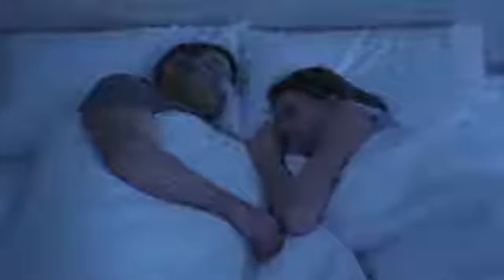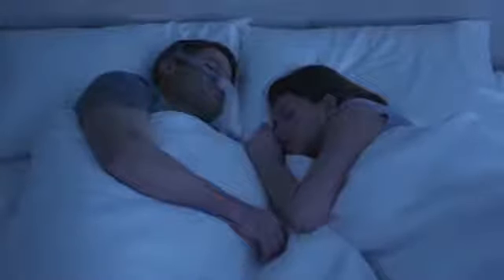ResMed's AirFit P10 Nasal Pillows Mask, with advanced quiet air venting, is a quieter mask to fit your sleep. Life starts with a mask that helps give you the sleep you need to enjoy every day.